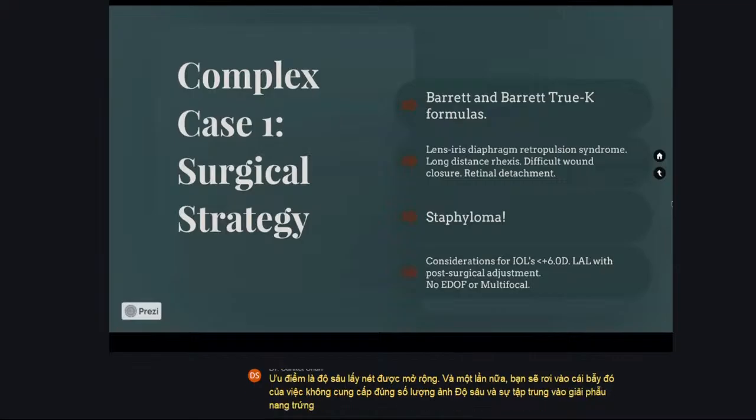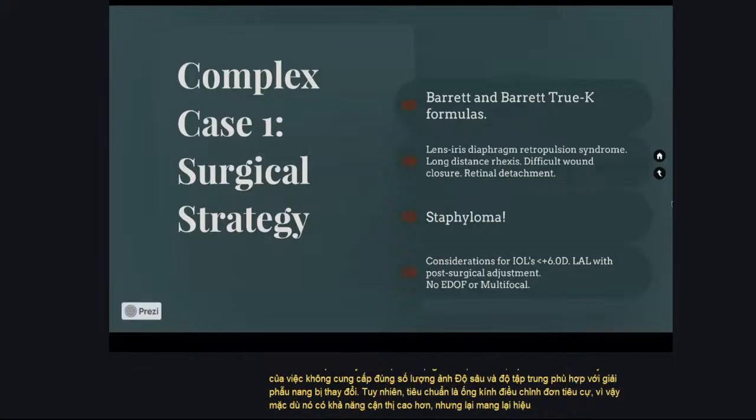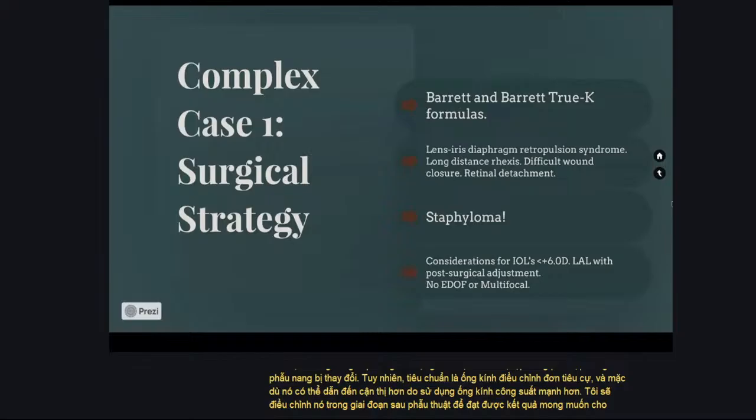However, the standard is a monofocal adjustable lens. And so, despite it ending up more myopic because it has a stronger power lens, I would adjust it in the postoperative period to get closer to the desired outcome for that patient while still having monofocal quality vision for a staphyloma.